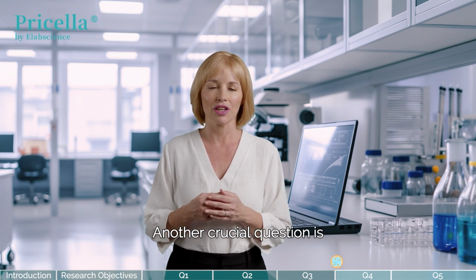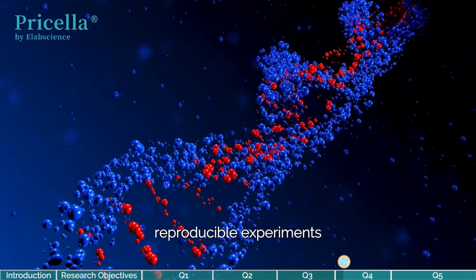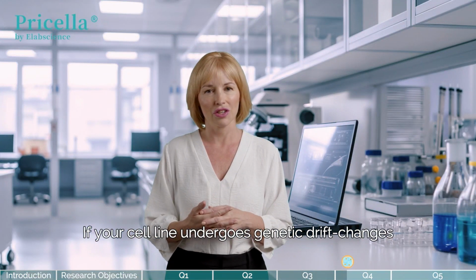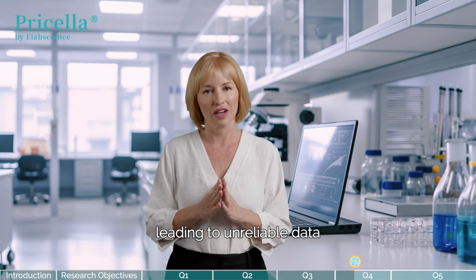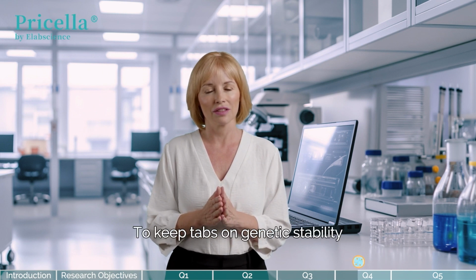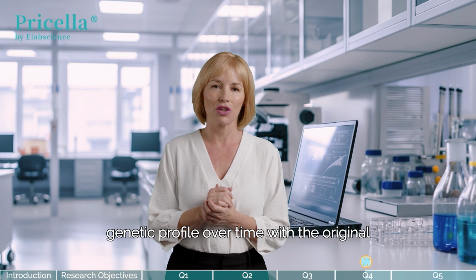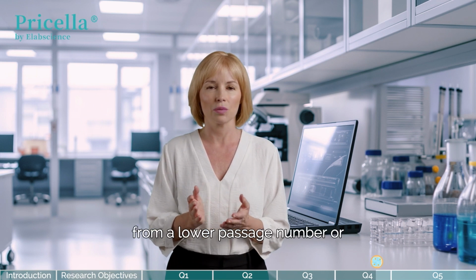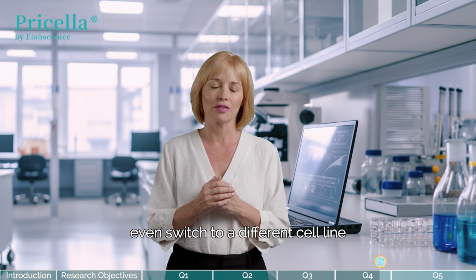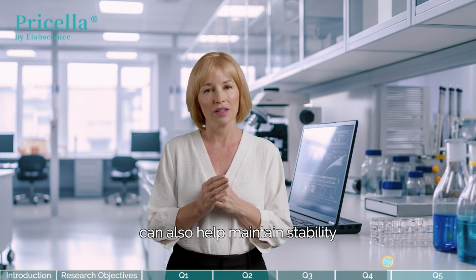Another crucial question is, is it genetically stable? Genetic stability is key for reproducible experiments. If your cell line undergoes genetic drift, changes in its genetic makeup over time, it may not behave consistently, leading to unreliable data. To keep tabs on genetic stability, consider regular karyotyping or other genetic tests. These help you compare your cell line's genetic profile over time with the original or reference profile. If you notice significant genetic changes, it might be time to start a new culture from a lower passage number or even switch to a different cell line. Keeping an eye on passage numbers and avoiding excessive passaging can also help maintain stability.